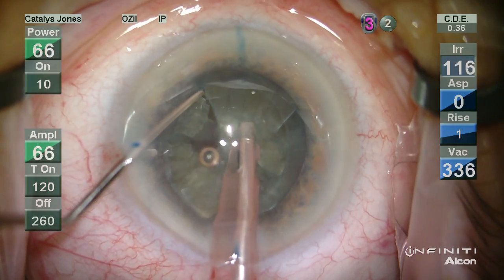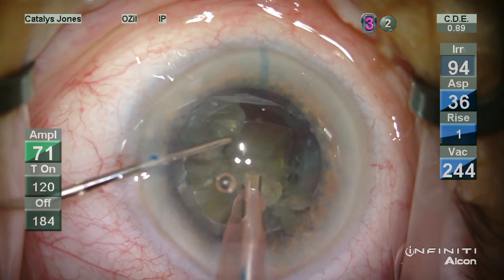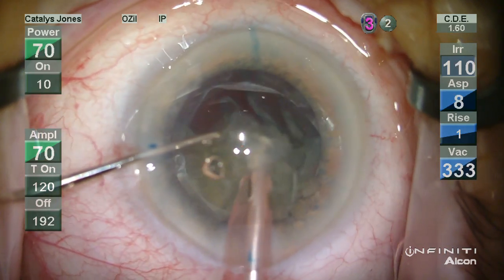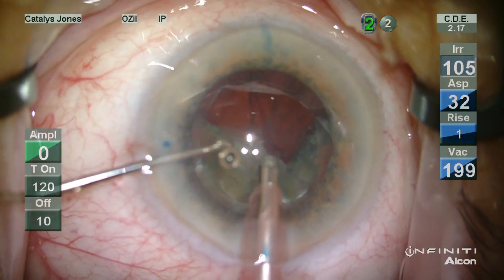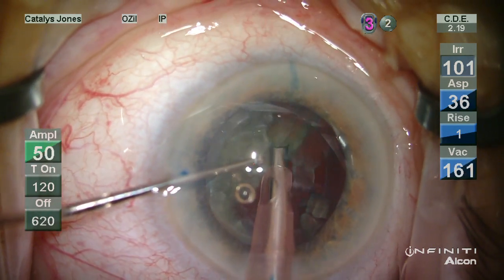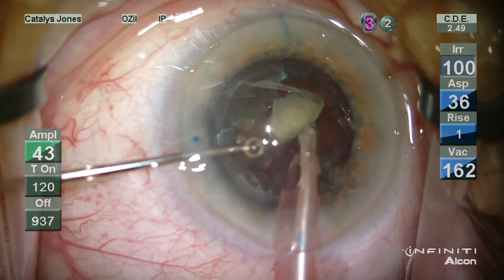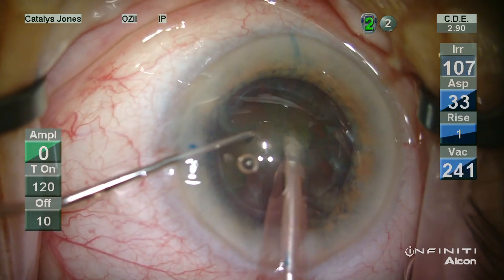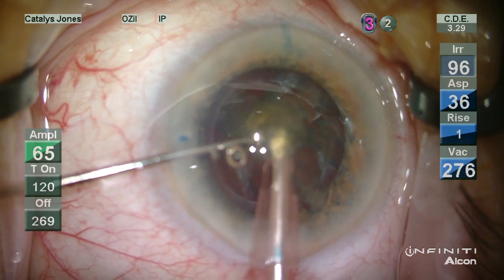The lens is then segmented. I've gone to a burst pattern of phacoemulsification using torsional ultrasound, and as you can see, this provides a very controlled manner in which to remove this softened lens. The burst pattern permits me to increase the frequency of applying ultrasound by depressing further in foot position 3. Additionally, there is linear control of the amount of energy applied with each burst, providing a very efficient and controlled manner of applying the energy at the amount and frequency apparently needed for each piece as it is liberated from the rest of the nucleus.